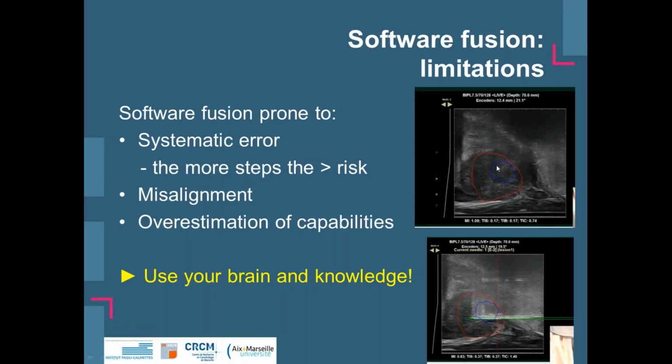As you can see here on the right-hand side, the prostate actually is here, but on the superimposed MR picture, the prostate is shown here, so there's really no correlation between the MR picture and the ultrasound picture, and actually the lesion is down here. So if you would take a biopsy of this one here, then probably you would miss your target.